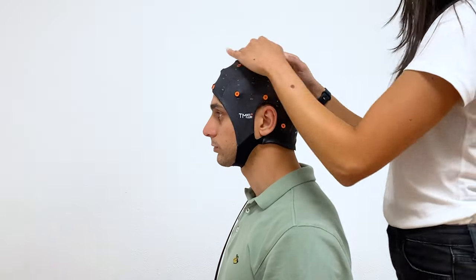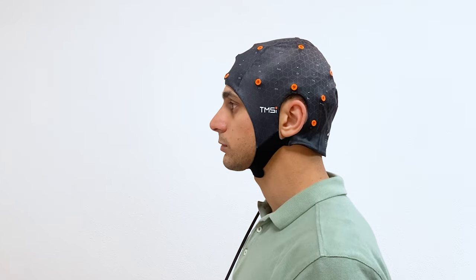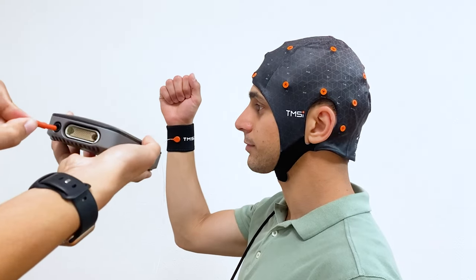First, place the correctly sized head cap on your participant. To find how to measure the head circumference, choose the correct head cap size, and correctly position your head cap on a participant — watch our video here. After placing the head cap, connect the patient ground and head cap connector.